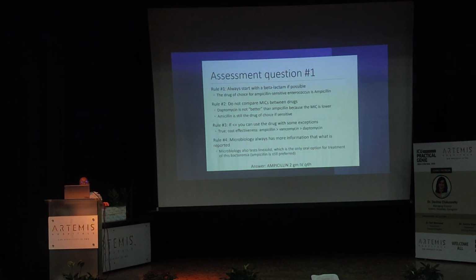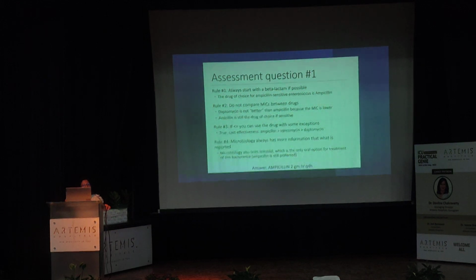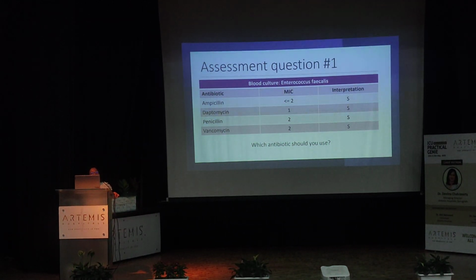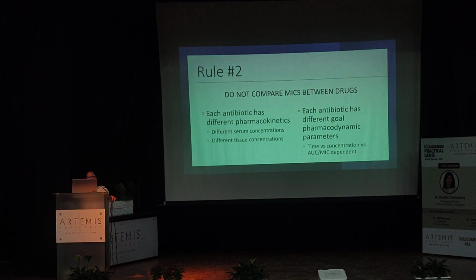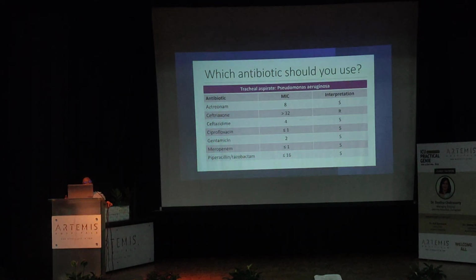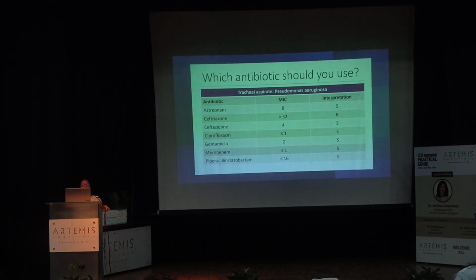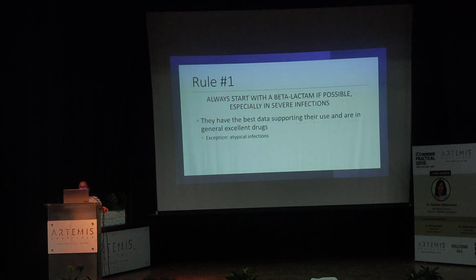One more important thing is, do not compare MICs between the drugs. When you decide which antibiotic to use, here we can see the MIC in this sensitivity report. Few drugs have MICs of less than 1, few drugs have MIC more than 32. This should never be compared, because MIC is different for different drugs and is meant for that drug only.